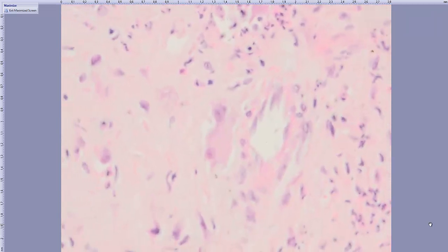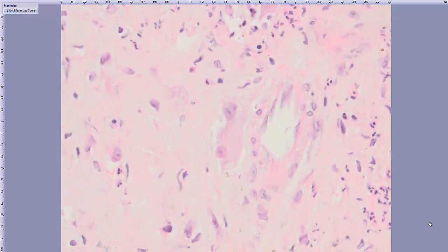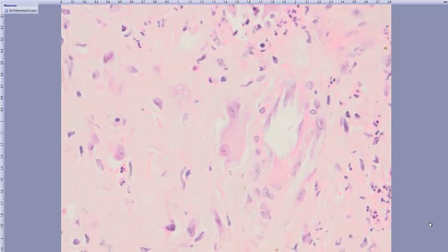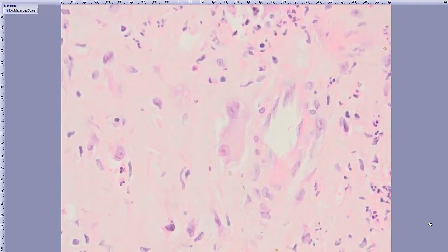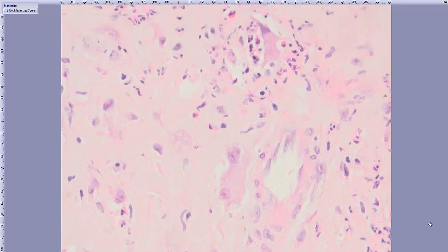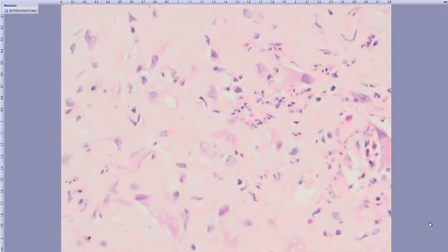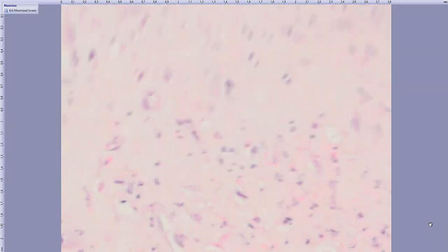Some of them look like Reed-Sternberg-like or virocyte-like cells.